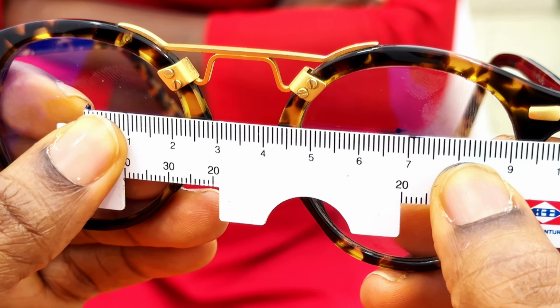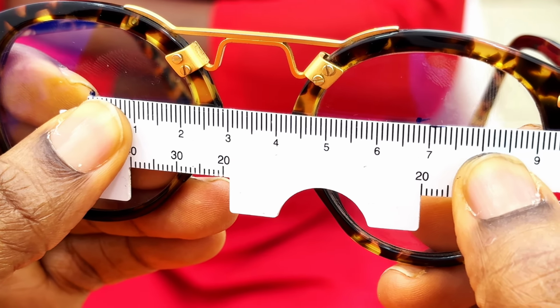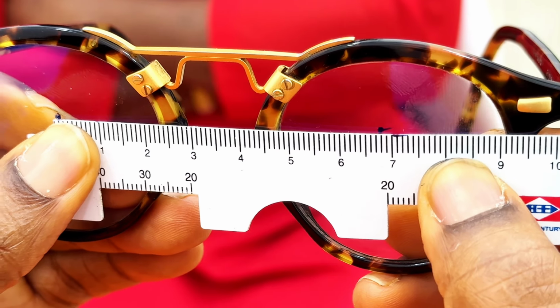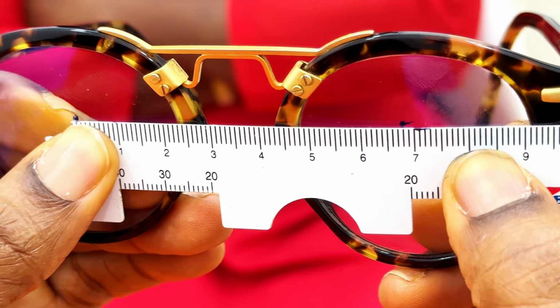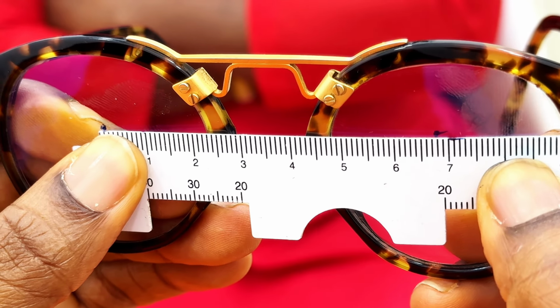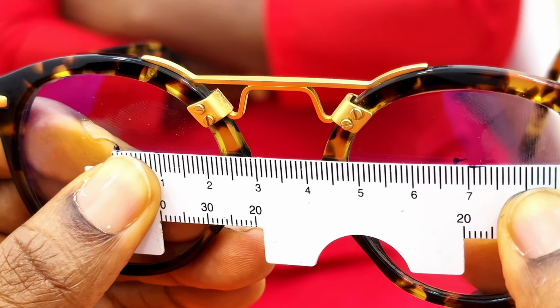So when you take it out, you can take the measurement from dot to dot. That's from the right dot to the left dot, and we're having 68 mm. That is your binocular PD. So you can also measure your binocular PD using your patient's frame and using this method of dotting. Now, this is your binocular PD.